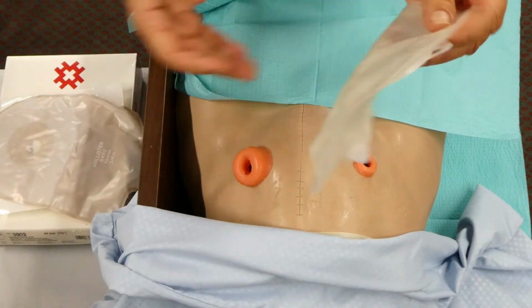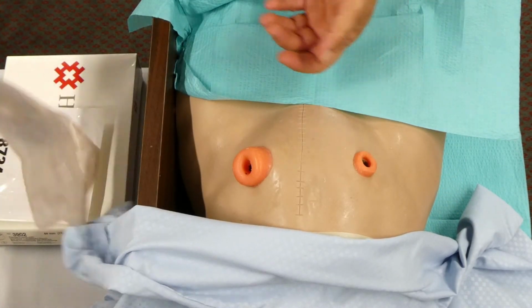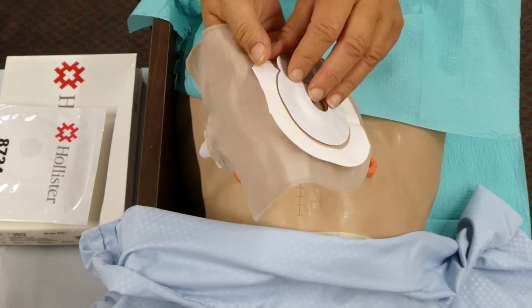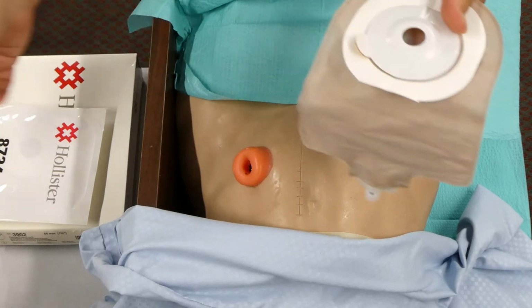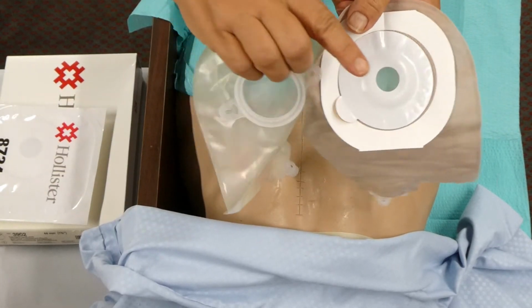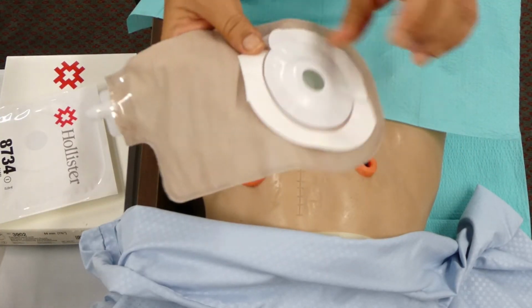Many different sizes, many different brands, different styles. Each resident will have their own, and you can't use one style for another resident. They're all very individual for the size and the type of ostomy they have.